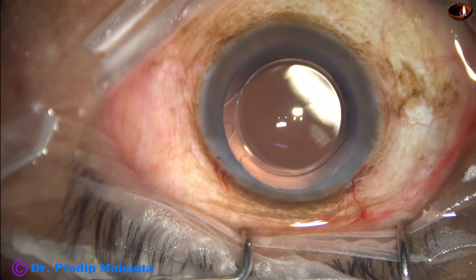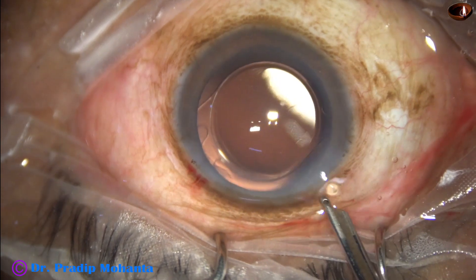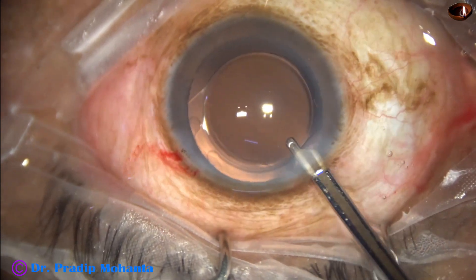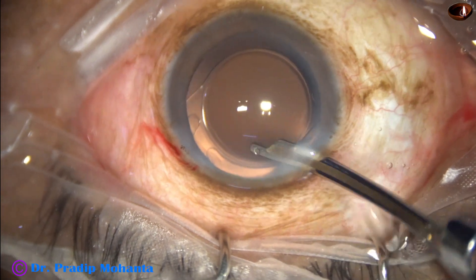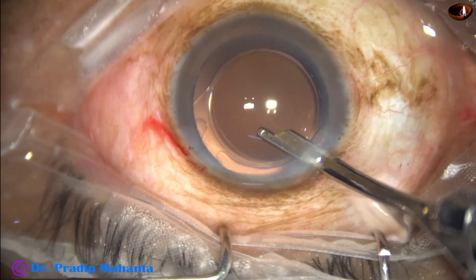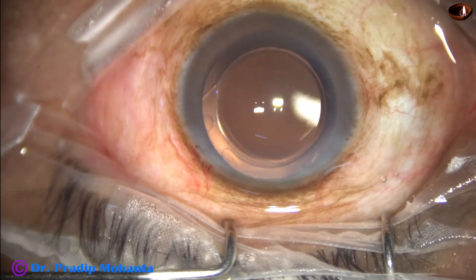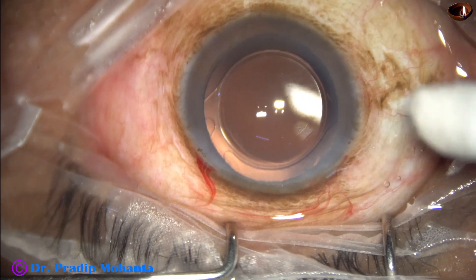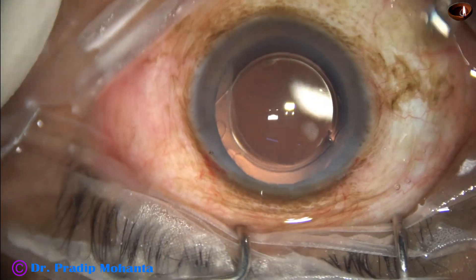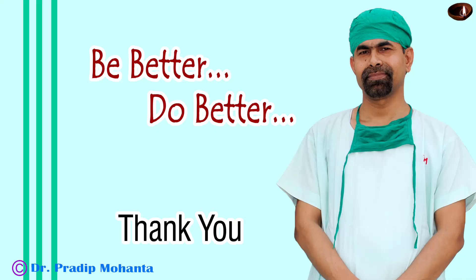A final lavage of the anterior chamber is done with the Simcoe cannula. The anterior chamber is nicely formed, integrity of all wounds is checked, and a few drops of moxifloxacin are applied over the ocular surface. The case is concluded.